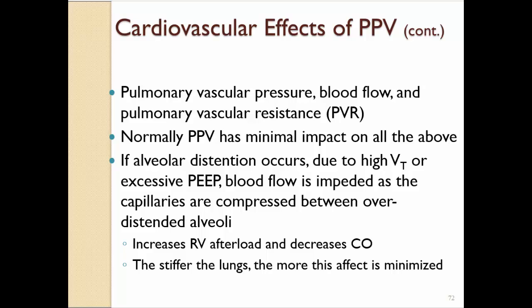So in relation to compliance, the higher the compliance, the more likely you are to experience cardiovascular side effects. So typically in ARDS, or the low compliance diseases, if you have blood pressure problems, and many times you do, it's not related to the mechanical ventilator. It's usually related to the sepsis or whatever initially caused the acute lung injury or the ARDS to begin with.